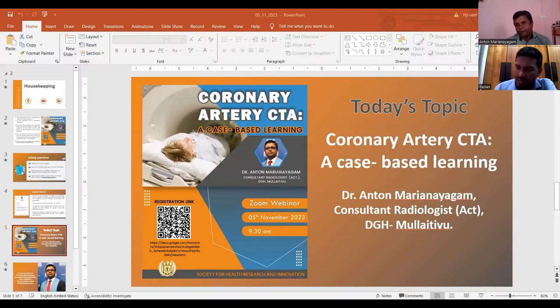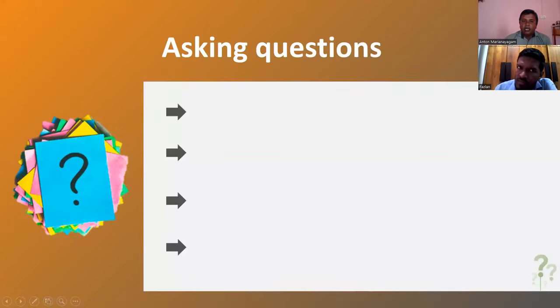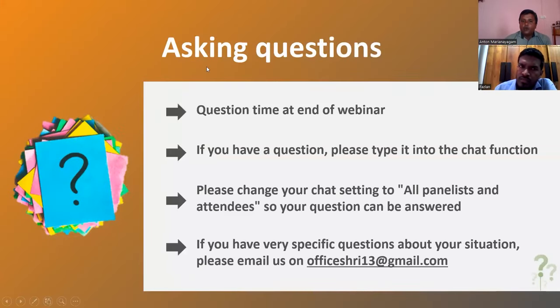How should a CKD patient be prepared for a cardiac CT when indicated? Yeah, of course. This is a general question. What we do is, in circumstances where we can avoid contrast injection, and if we can get the needed information from a non-contrast CT, we proceed with the non-contrast CT.